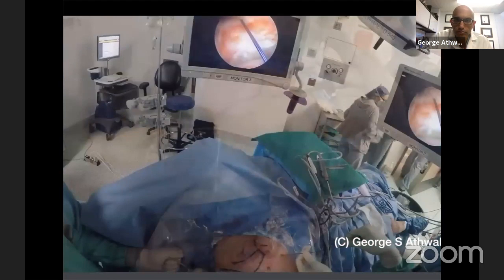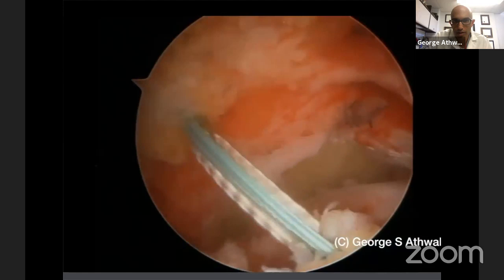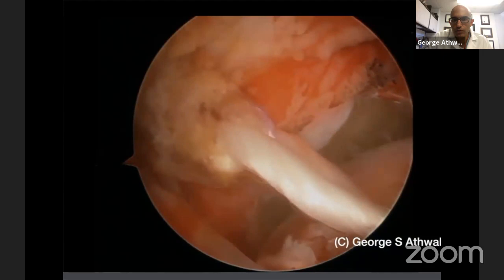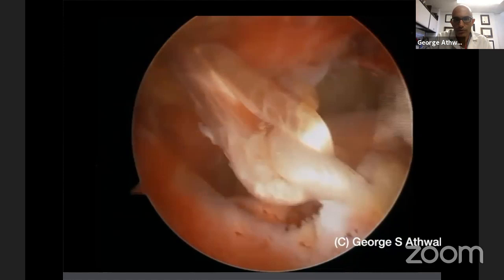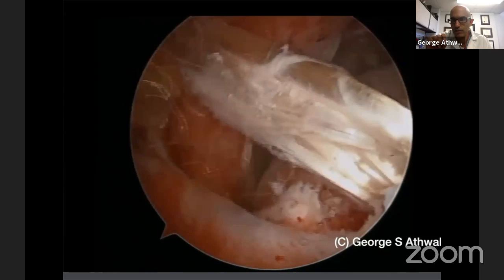There you can see it happening live and also on the camera. So there's our suture shuttle. She's pulling on that. There are the sutures for the cortical button. There's the cortical button. There's the loop. And then there's our doubled over graft. And remember, I only sutured one limb of the graft. So that's why the graft slides through the loop. And so now this is the front of the shoulder. I'm going to pull out my cortical button, flip the button. And so now we have our suspension fixation of our tendon transfer.